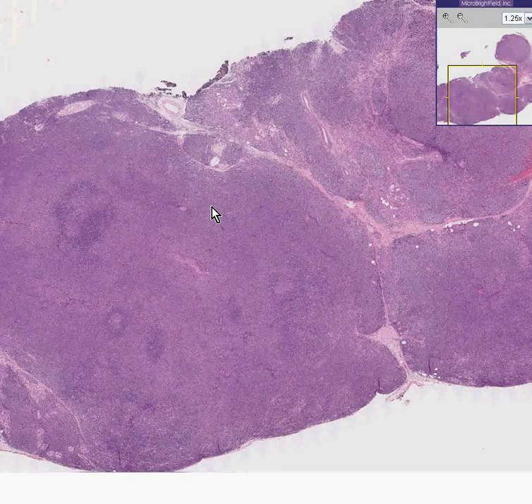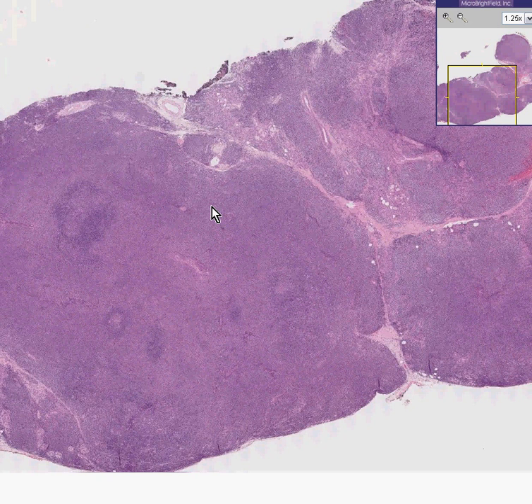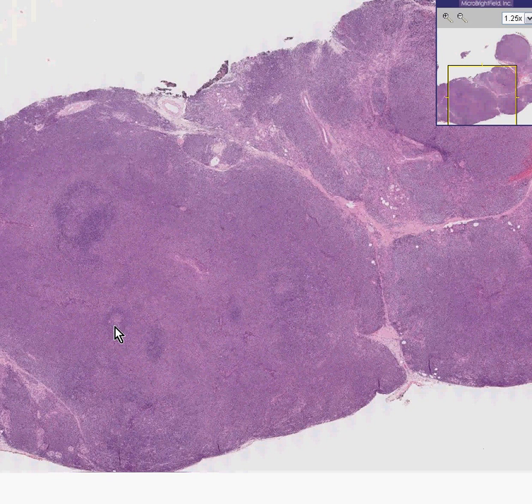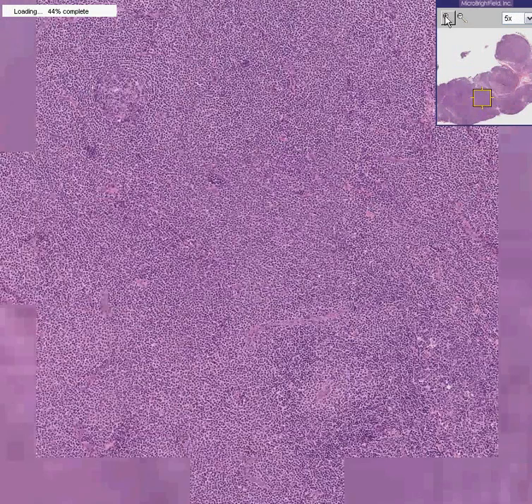You're so smart by now, you can already see this is some kind of lymphoma. You're right — it is a lymphoma because it has lymphoid type of cells. You can see that already, even at low power, and it's growing in a diffuse pattern in which there is absolutely no normal type of lymph node architecture present, although you do see maybe one, maybe two, maybe three residual secondary follicles with germinal centers.